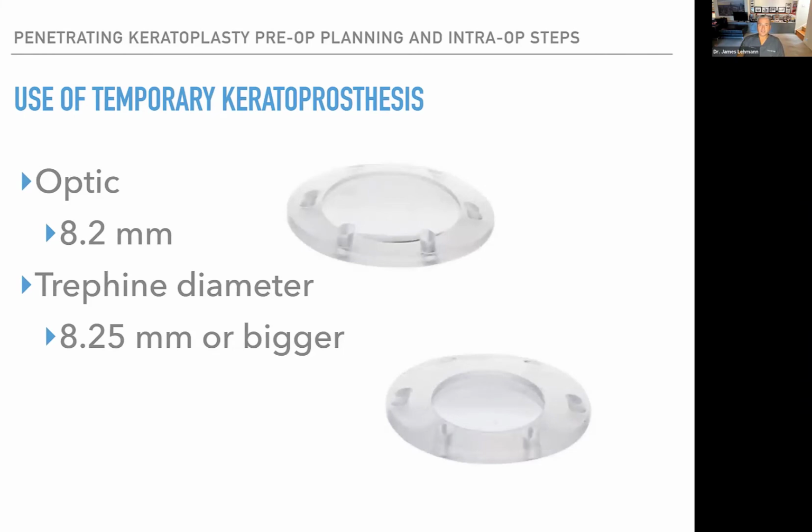So I like to cut it under the scope. Most countries I've been to, they don't do it under the scope, but I think you can center it better under the scope.